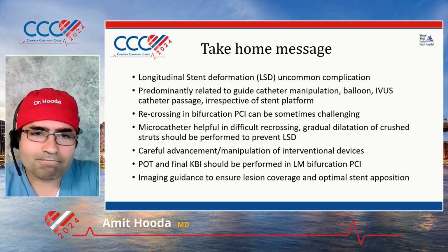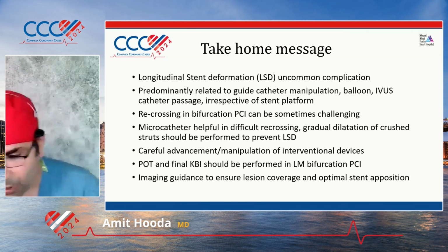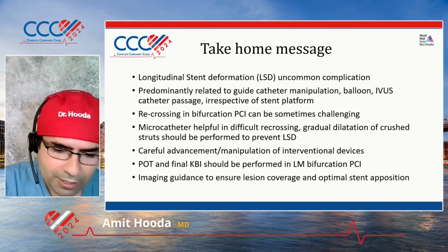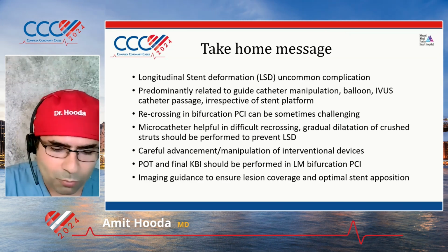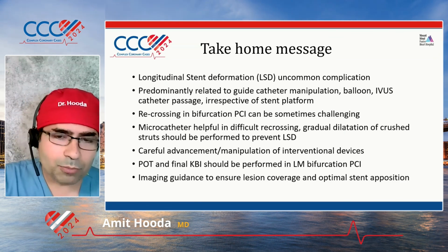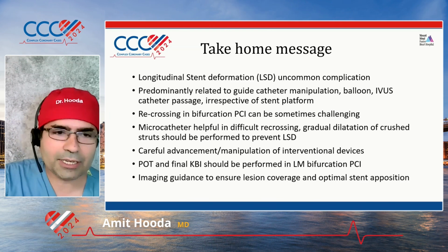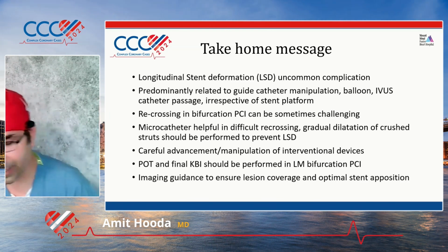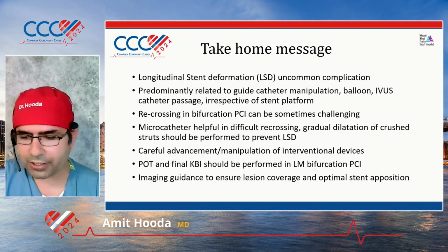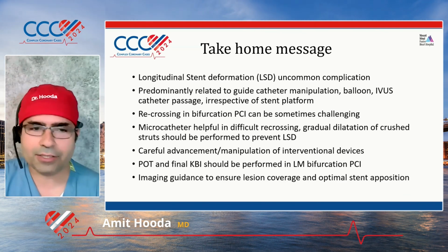This is a fantastic case. So as you see, LSD is uncommon, but it can happen irrespective of whichever stent type is used. Earlier in the past, it used to happen with Promus more, but not with the later generation of Promus. And mostly it's because of guide catheter manipulation, or when we try to pass a balloon or an imaging catheter. But I think in our case, because we were anchoring and it's an angulated circ, with a little more force, the balloon just crumpled the stent distally.